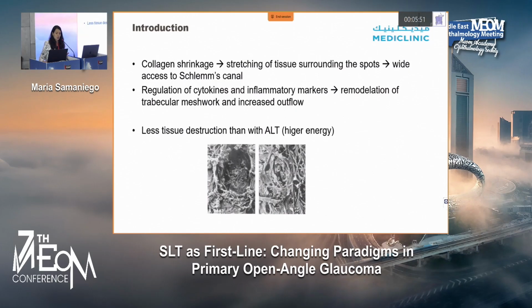So here in these pictures, you can see the difference in terms of tissue destruction. The picture on the left is done with ALT. The picture on the right is done with SLT.